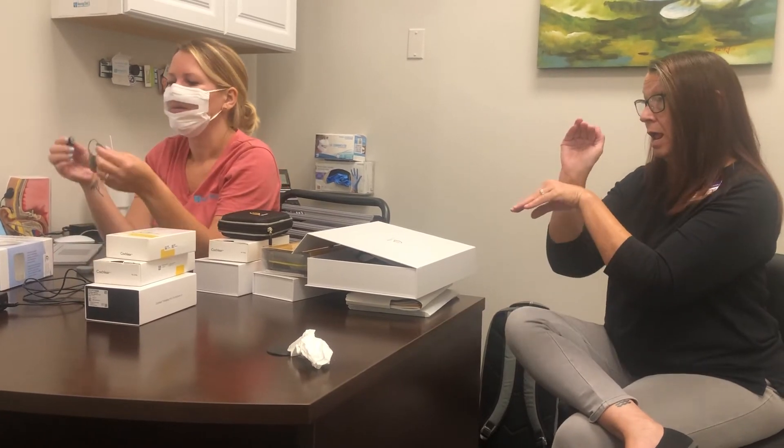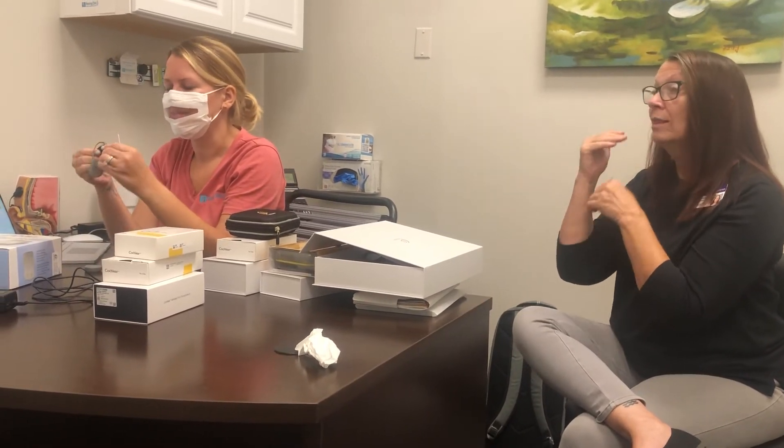You will leave the battery on the charger even when it's fully charged. You have two batteries — if you wear the Nucleus 7 every day, you'll have one on your head and one on the charger at all times. Then you'll rotate in the morning: even if the battery is not dead, you'll put a fresh battery on and put the old battery on the charger. It should last about 20 hours, but you'll change it every morning anyway.